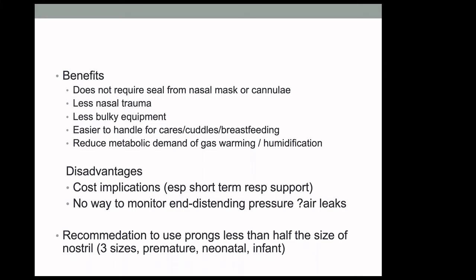Additionally, with CPAP, you have a measured pressure that you deliver, so you know exactly what you're giving, whereas with vapotherm, the amount of positive airway support that you're providing can be quite variable, so there's no way to monitor that. And also there have been reports of increased air leaks with vapotherm.